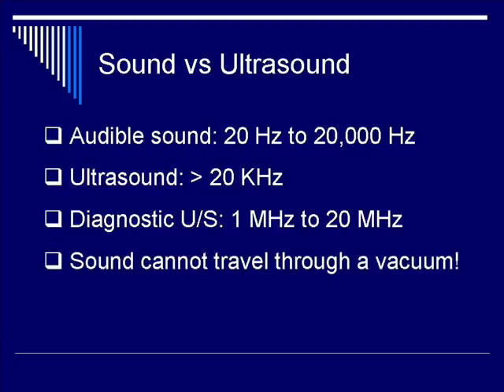Unlike electromagnetic waves, sound depends on a physical medium for propagation. Therefore, sound cannot travel through a vacuum. From here on out, it is instructive to think of sound waves as energy. As an ultrasound beam traverses the body tissue, think of the sound wave energy being dispersed, refracted, reflected, transmitted, and absorbed. Having this understanding will serve you well for future lectures to come.